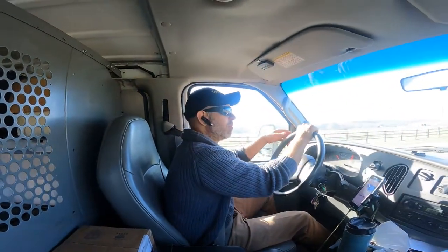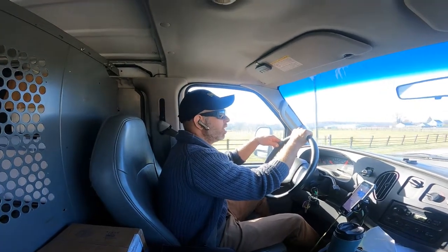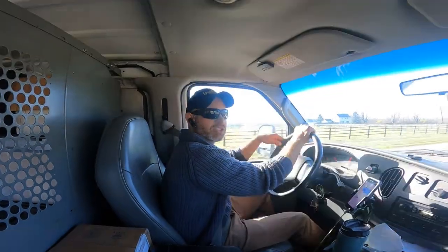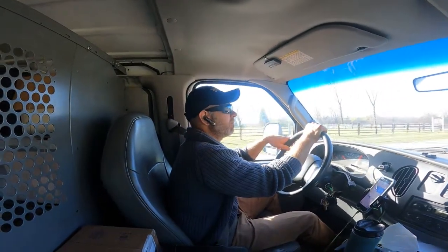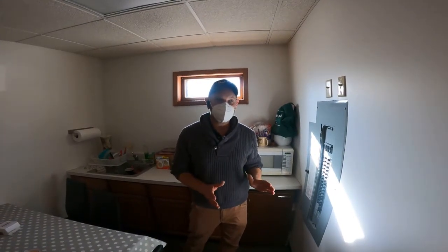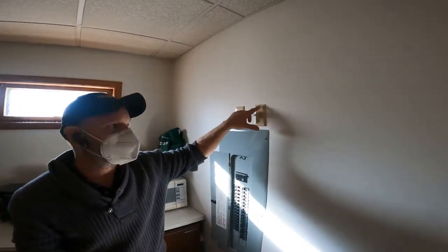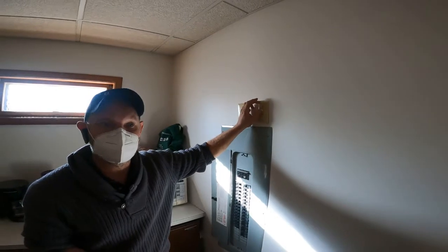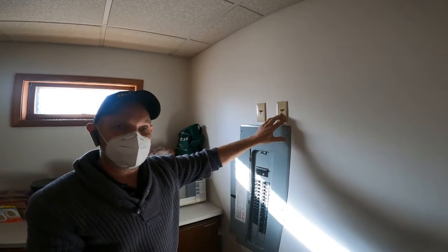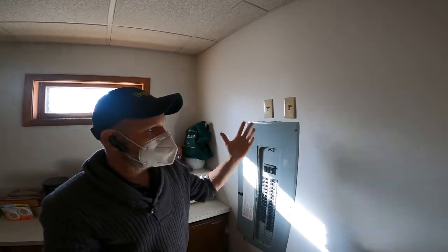The dental vacuum system that's not working is impacting their ability to treat patients, so this was an emergent service call. Our every intention is to get it going today and help the customer. Here we are with a vacuum system that's not working. The main switch for the vacuum is right up here — we have a C and an S, so this suction side is the one that's not working. This is a standard light switch, commonly used to activate vacuum pumps, and the customer says when they move this, nothing happens.